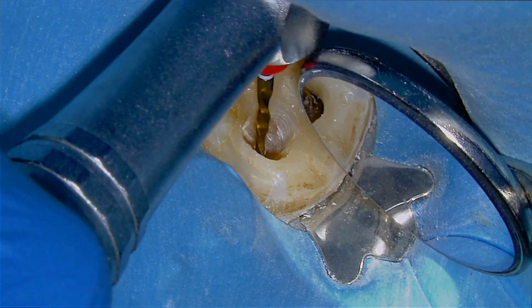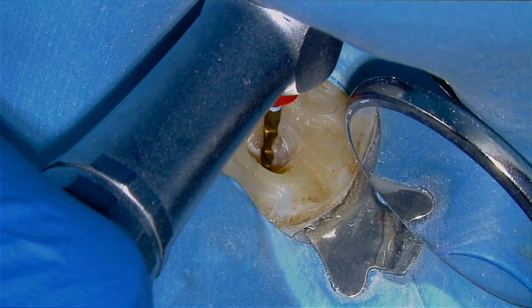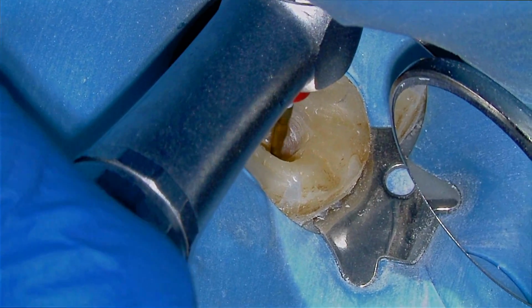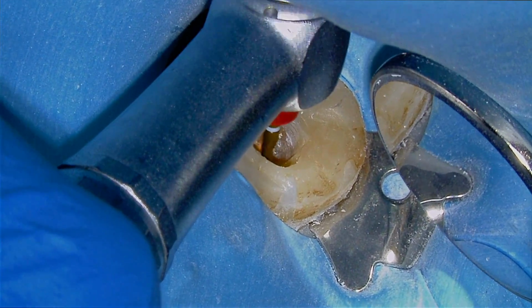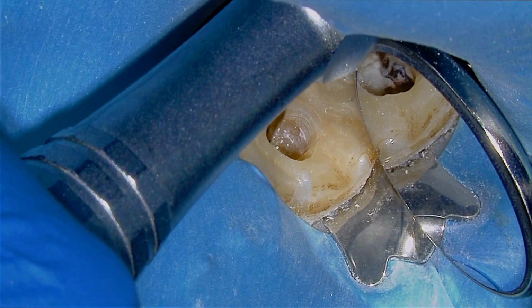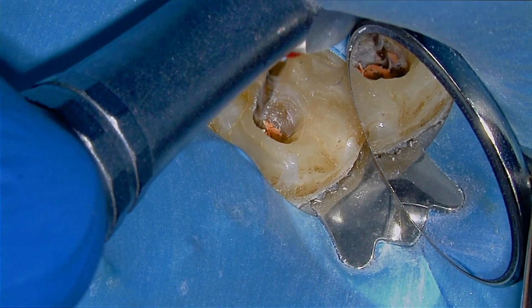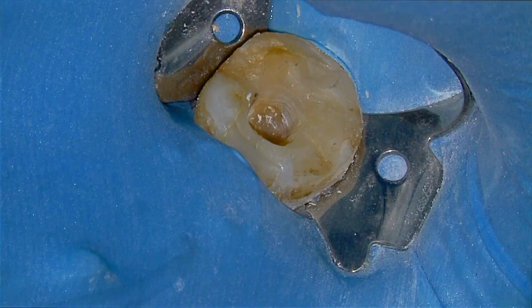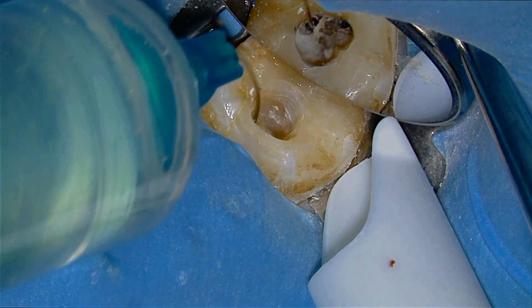So what I'm going to do is hit the motor and spin this file in reverse, because the Wave 1 Gold cuts in reverse, and I'll spin it at about 1,000 RPM, just like a rotary file, and you'll find that the gutta percha just comes flying out. So I'll do that in both canals, the mesial buccal and mesial lingual, and I caution you on doing this technique. If you want to try it, do it in extracted teeth, because this file is not designed to cut in reverse at 1,000 RPM.